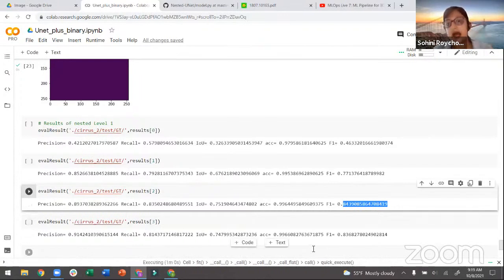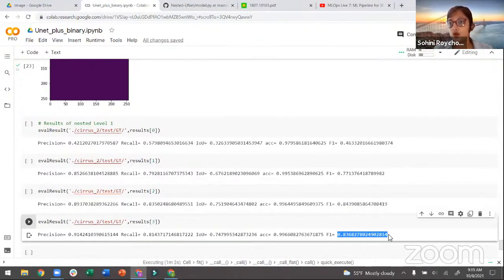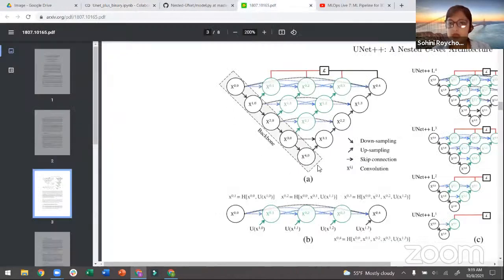So which is actually higher than what you would get at one more level of depth, right? Ideally what this whole set of results is showing you is that, for this particular instance of Unet, a depth of 3 was good enough. While you go to depth 4, you are adding 4 extra neurons in order to go from the skip connection from the image here to the final outcome. And at this point, you are just going on adding nodes, right?